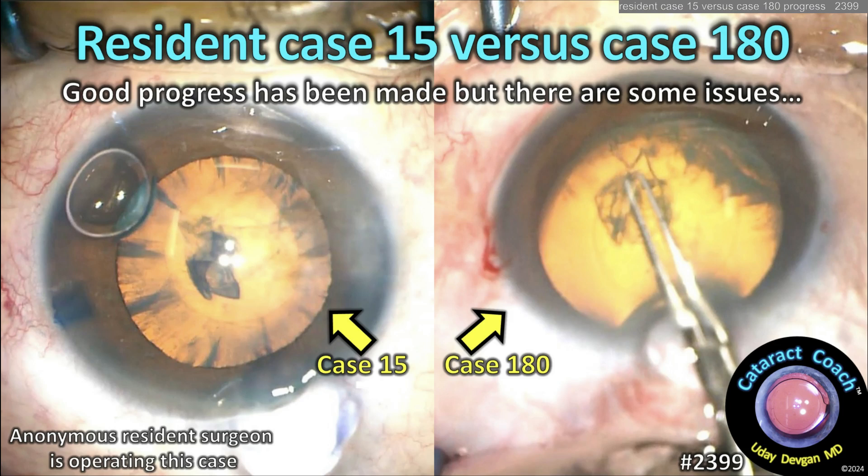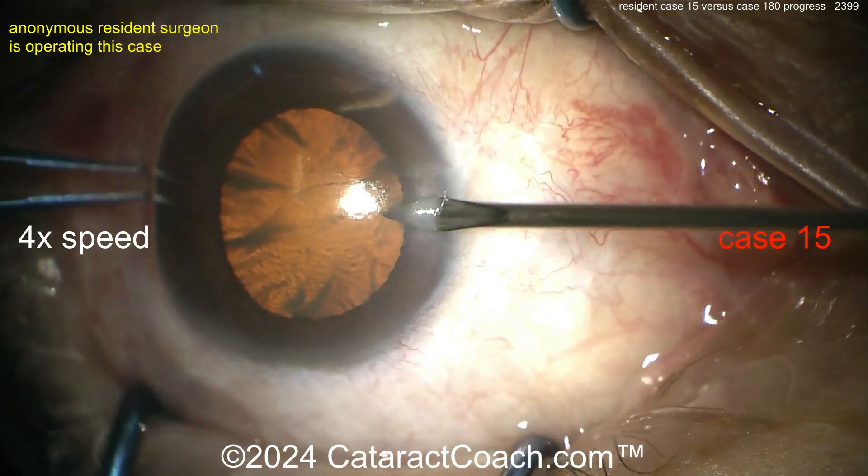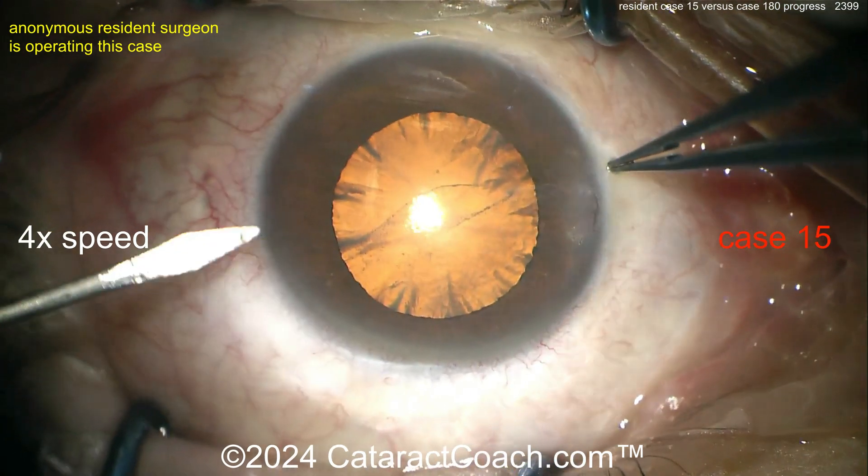CataractCoach.com resident case number 15 versus case number 180. Good progress has been made by this resident, but there are a couple of issues. Let's go into it. Here's case 15 — we sped the video up to four times normal speed just so we can get through it.